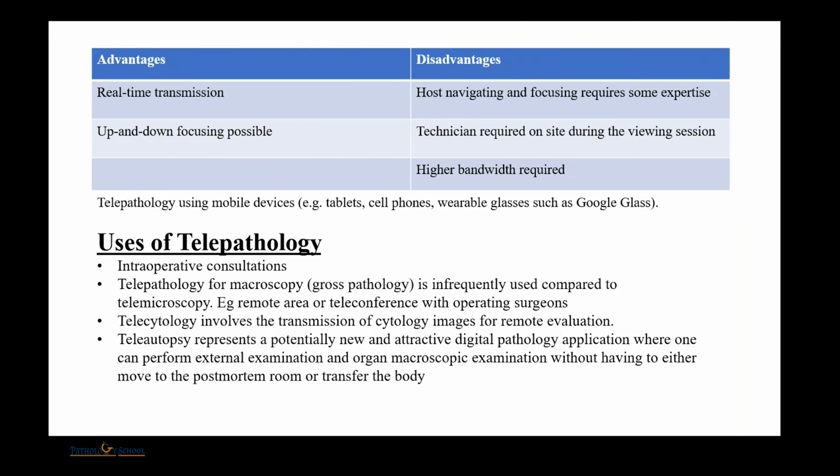Next is your telecytology, where you transmit cytology images. And lastly, a new concept, which is teleautopsy, wherein you send the external examination and organ macroscopic examination to the telepathologist if you don't have an experienced staff pathologist with you, without having to move to the PM room, or without having to transfer the body from one institute to the other.